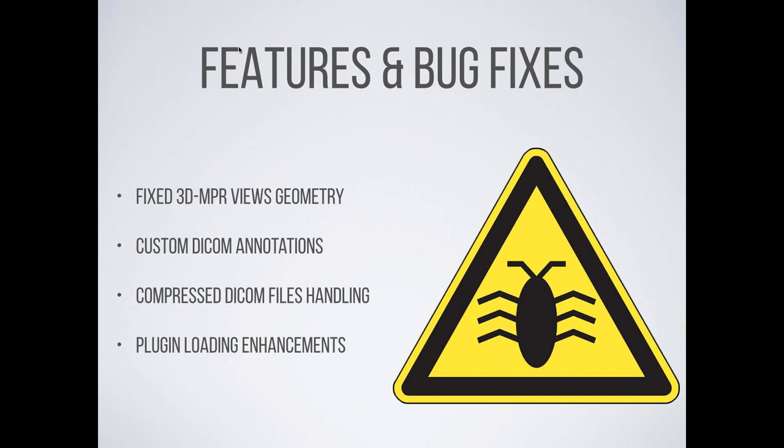Fixed the 3D MPR views, the geometry that was being used in those views. We've addressed custom DICOM annotations, compression of DICOM files and how they're handled. And we've made some enhancements to plugins and how they'll be loaded in the future and how they are loaded today.